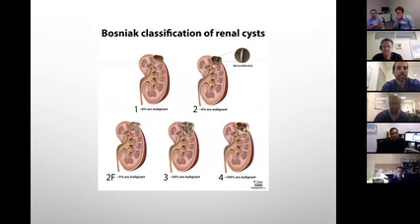If you see a cyst, look for septations like this. If you don't have any septations or just one thin septation, less than 3 millimeters, like a gallbladder wall, they're all fine. No septation, thin septation is fine. If you're getting multi-septated, thick septations, they are bad. They all need investigation. 2F means follow-up. These people need follow-up. 3 and 4 are bad. So that's all you need.